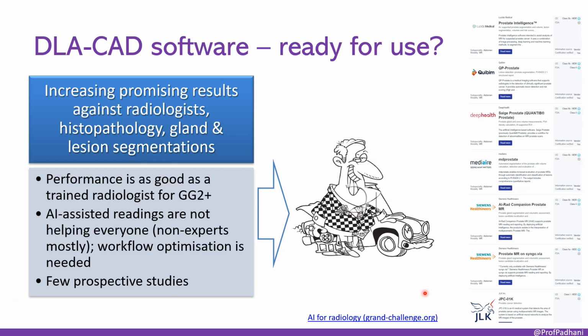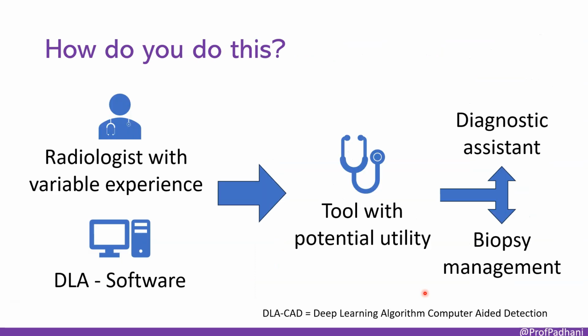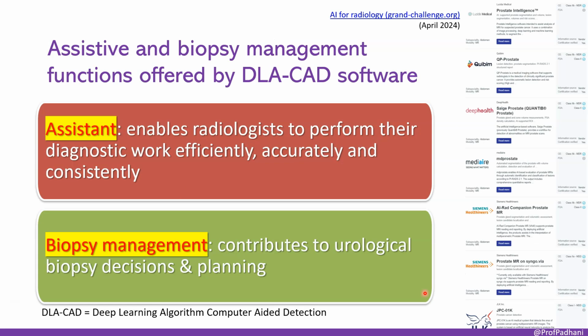Okay, so conceptually, how should you think about using these tools? Slide 10. The idea is to see DLA-CAD as a diagnostic assistant, something to help radiologists, maybe especially those with less experience, improve performance, consistency, and aid in biopsy management and planning. Got it. And slide 11 broke down the typical functions into two main roles for you.